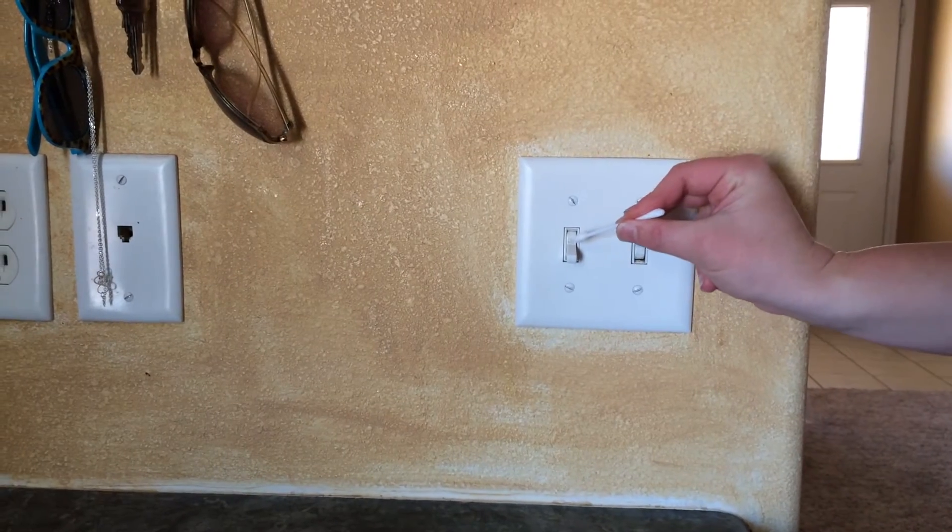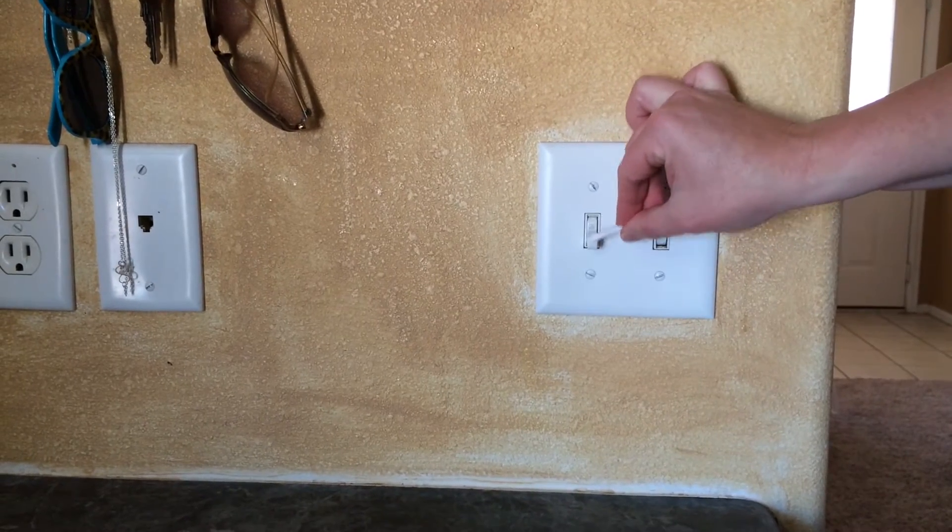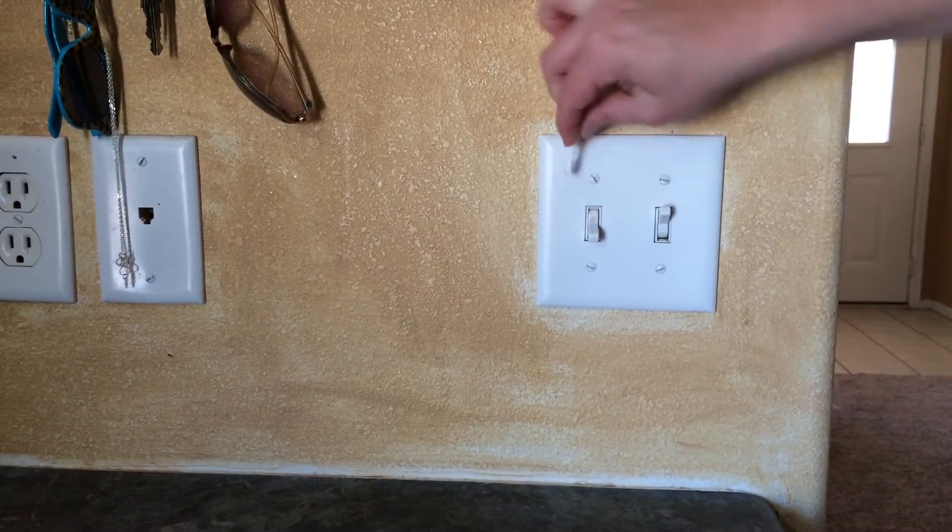You can apply a small amount to the top of the light switch, remembering to rub it in. Now we're going to look at the areas where we've applied the surface cleaning detection gel with the use of an ultraviolet light.